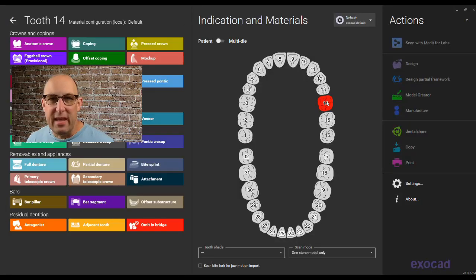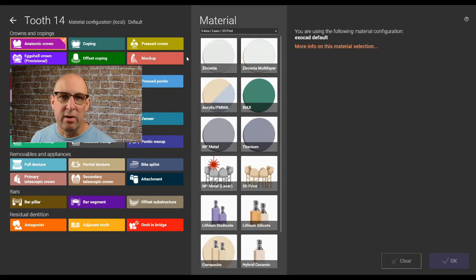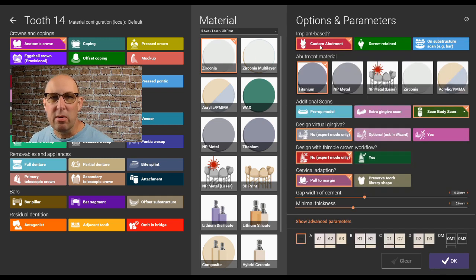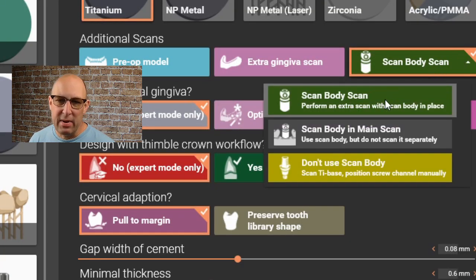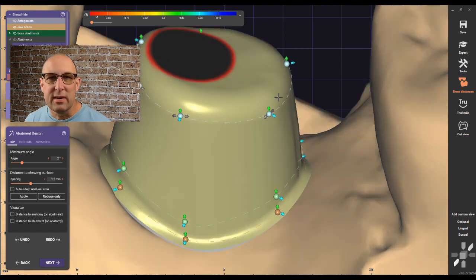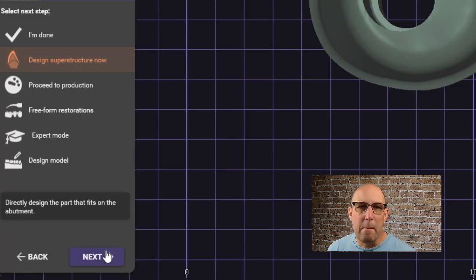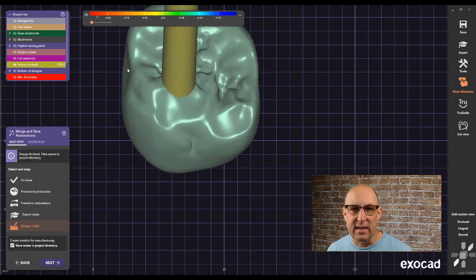Welcome back to the video. The first thing we're going to do is select a crown and material — zirconia in this case. For the abutment material, choose titanium. If you have a separate ScanBody scan, use the ScanBody scan; if not, use ScanBody in the main scan. Click OK. I'm going to focus more on the actual exporting of the screw channel and cutting a hole, rather than the abutment design.